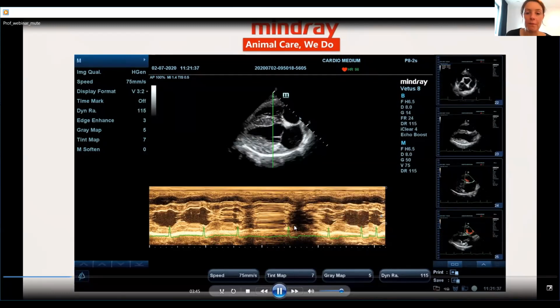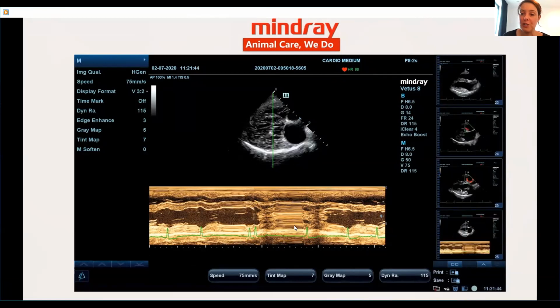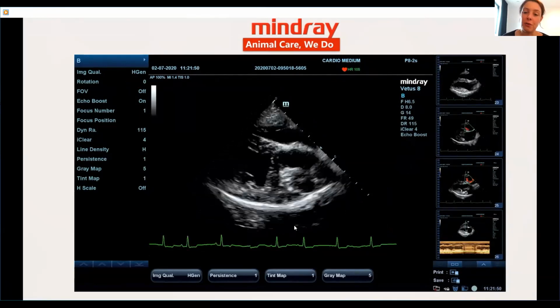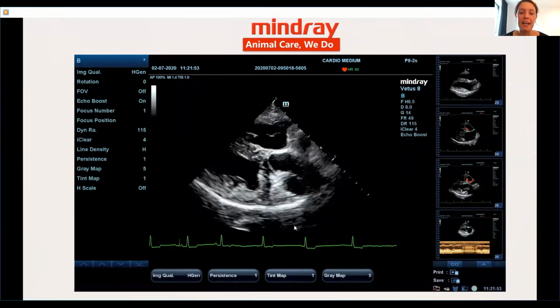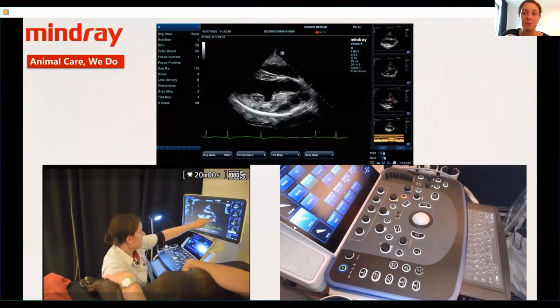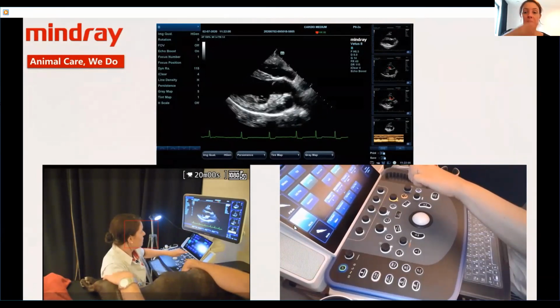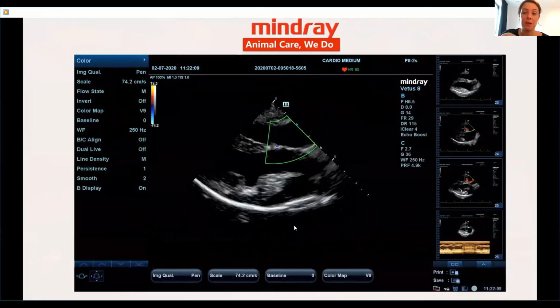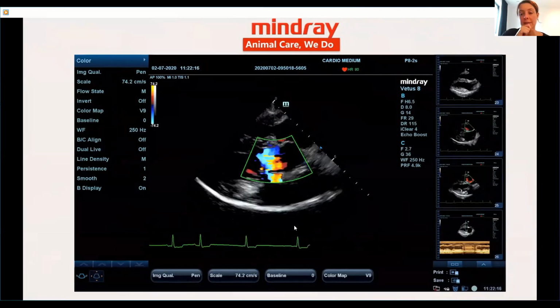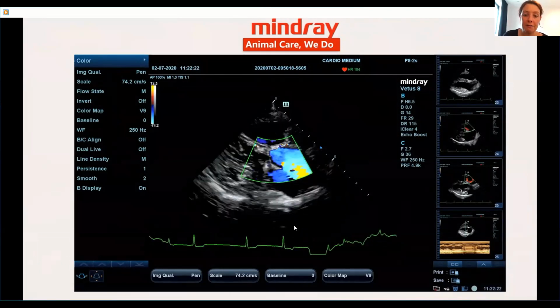I have to say that I made this exam a little bit challenging because I took a little French bully as a model, and she's completely sweet and nice, but when she lies down for an echo exam, she starts to snore, of course, and her respiration is quite pronounced. So you see the heart moving quite a lot with the respiration, and that is also a problem that you will be facing in practice, that sometimes when you're doing measurements and when you have dogs, for example brachycephalic dogs that breathe quite deeply, you will see the heart moving, and that also causes these movements that you saw on the previous image.